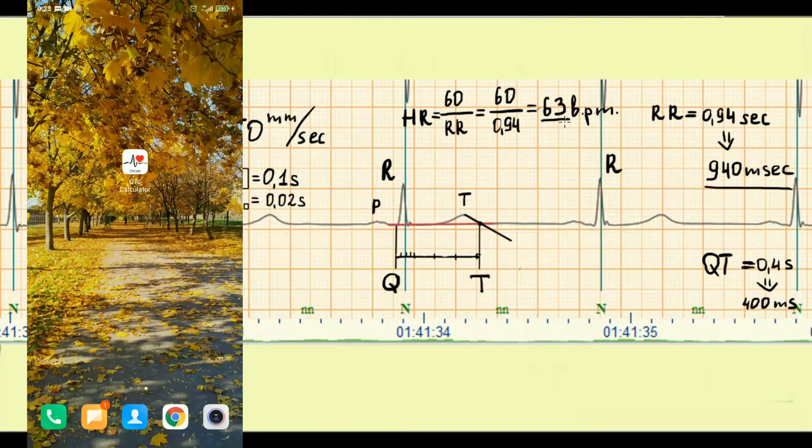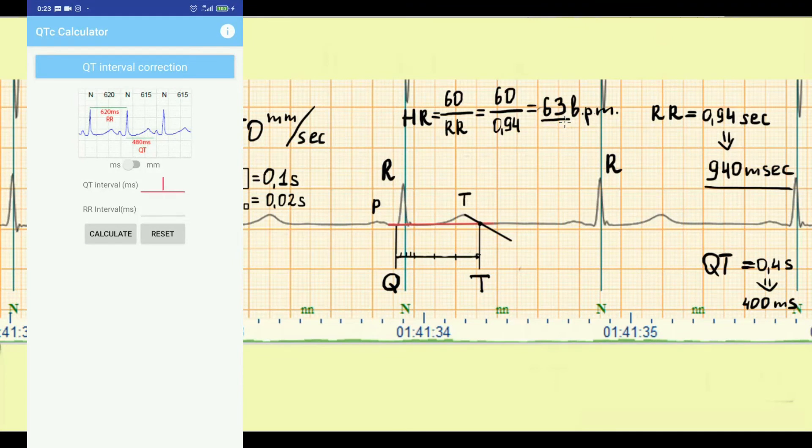There are lots of online calculators or applications for calculation of QTc. In this app we need to put RR interval in ms and measured QT interval. Fortunately apps calculate simultaneously by all common formulas. So, in our example we use Bazett formula and corrected QT is 413. The links for downloading apps for your smartphone you can find in description.